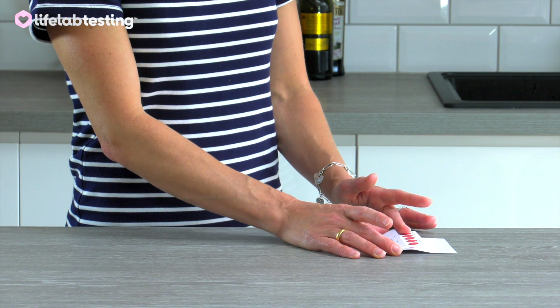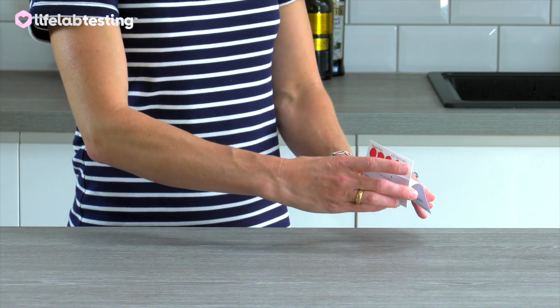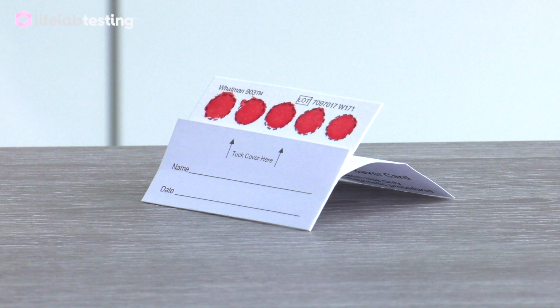Once you have filled all of the circles, slightly bend the collection card away from the cover to allow air to flow underneath the blood spot collection card. Please allow between 5 and 10 minutes for your sample to dry.